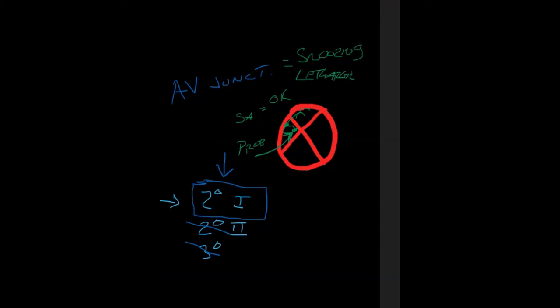So it's delaying things a little bit longer, and it delays a little longer, and then eventually it doesn't let a beat come down through. Now, what's kind of scary about this is that the ventricles could or should, depending on the rate here, provide some backup.